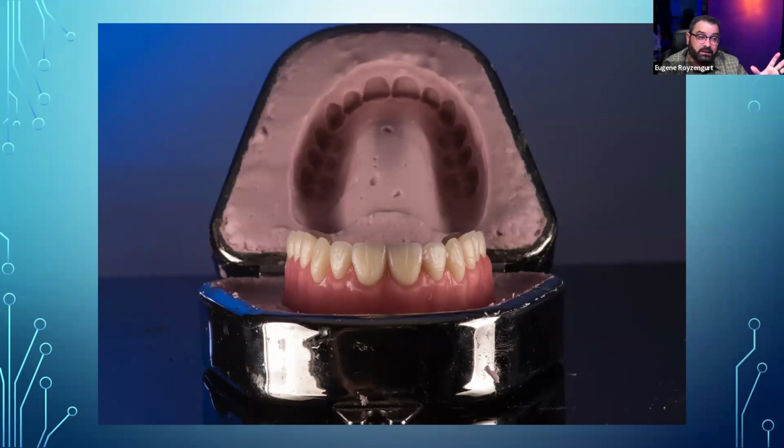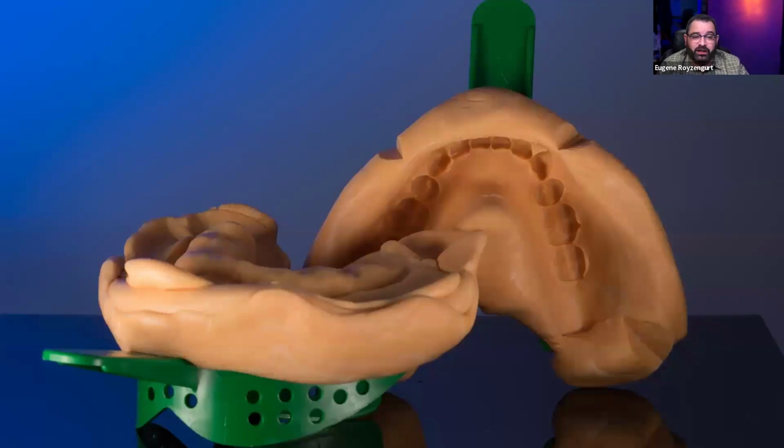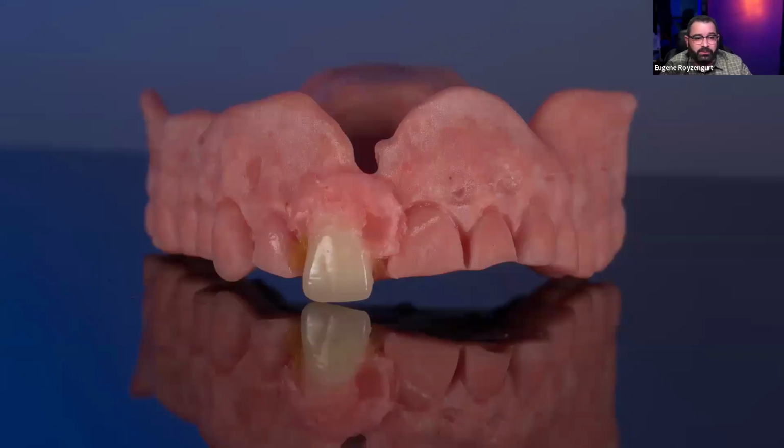Not as great, but it worked. And we've even done them with just using the other sides of impression trays. So whatever was working at the time, we were using it. And we would either do them in orthodontic resin, or this was a tray resin that we used. As you can see right here, the teeth were short, and I was actually chair side placing a denture tooth in there to adjust things.